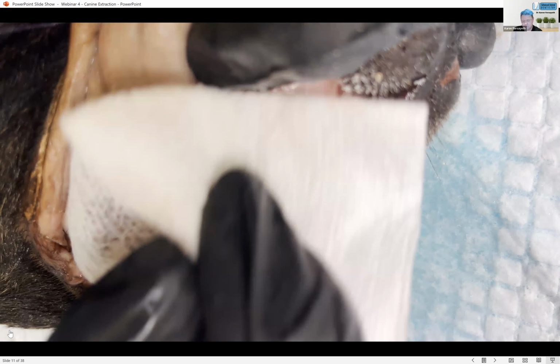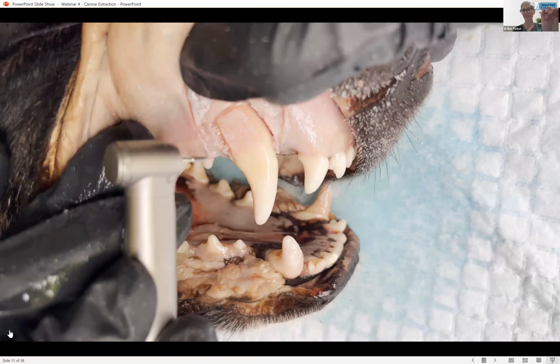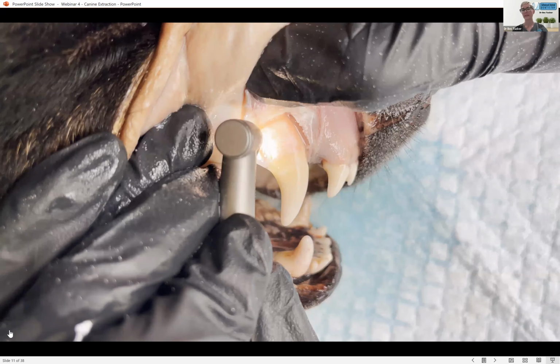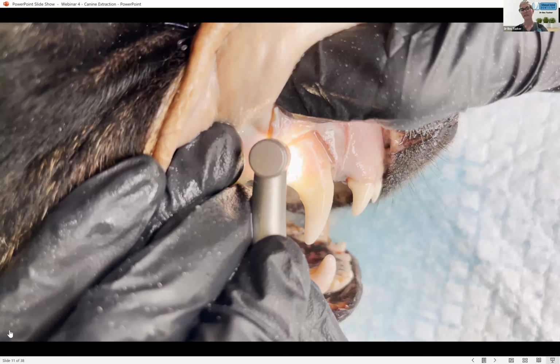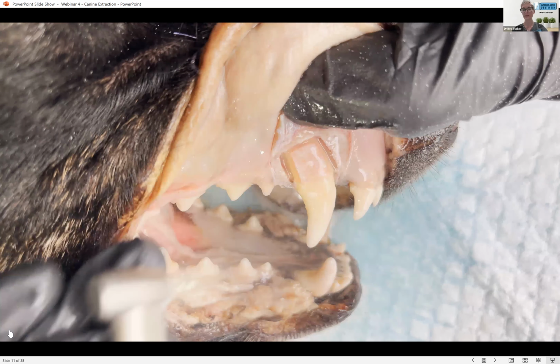And I also don't just pop the drill in and try and pull down and cut. It's little sweeping motions, and that clears the burr of debris. You'll find it'll bind less. And it's just really gentle, controlled motion that we use.